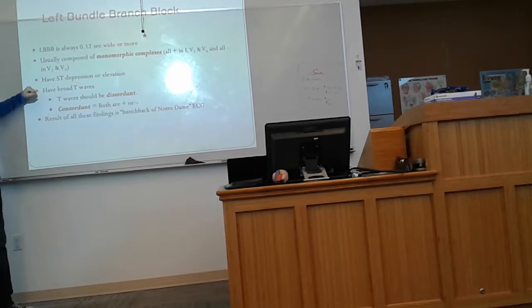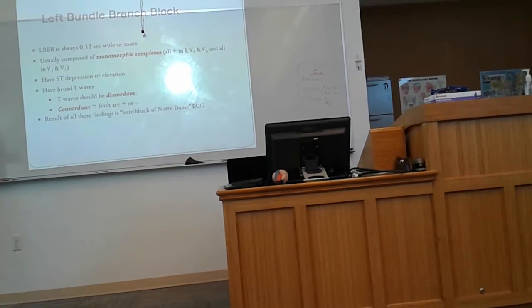The T waves will be broad, big, and they will be discordant. What do you mean by broad and big? Like long along your x-axis? Yeah, so they'll be just wider and taller than what you normally would expect them to be.